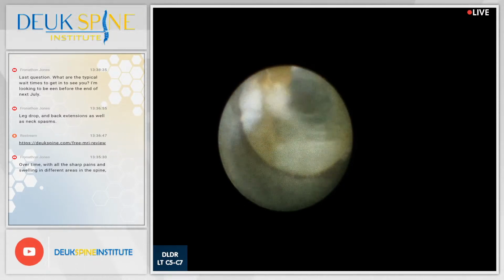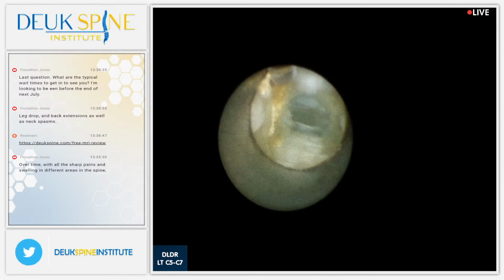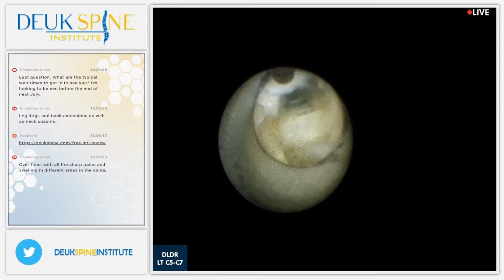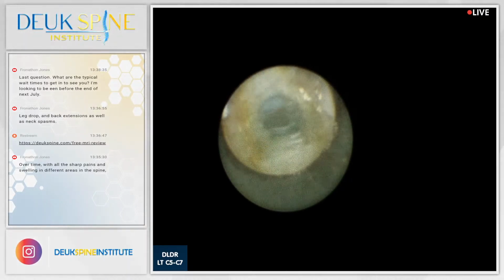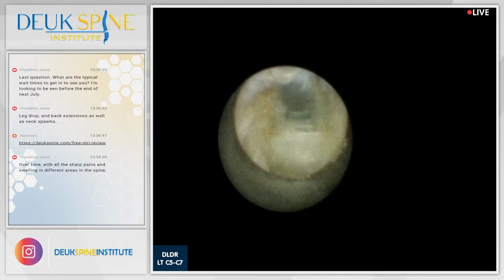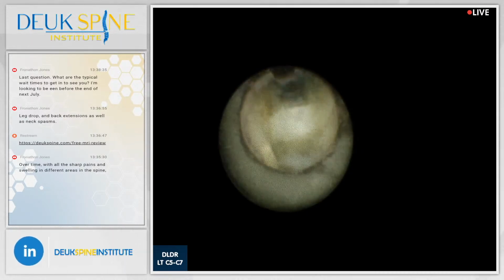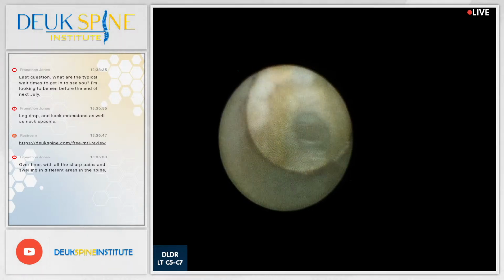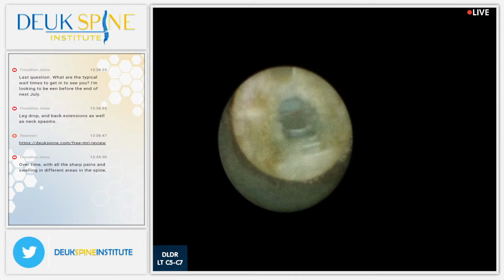Interesting. That's one of the advantages of endoscopic surgery, is you can actually see if things have gotten worse. And it has. That said, it's still fine. We're going to fix it for him. It doesn't matter if it got worse. But it's kind of like you're fighting a war. I love using military analogies. But you're fighting a war. Your intel says the enemy is over the hill. But it turns out the enemy is not just over the hill. They're actually over 3 hills, 3 different hills, and they're over all of them. So there's more enemy than you thought. You still have to fight the war, but it'd be nice to know that sort of stuff ahead of time. Unfortunately, I can't get that in everybody.